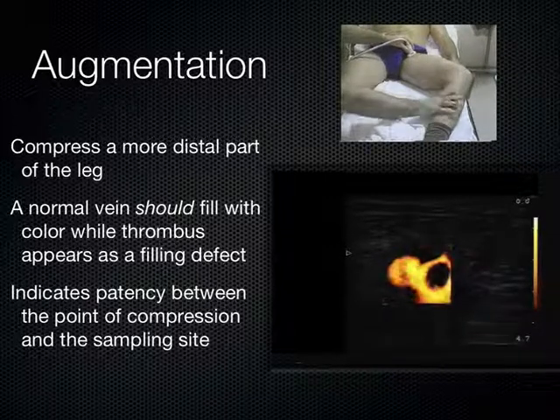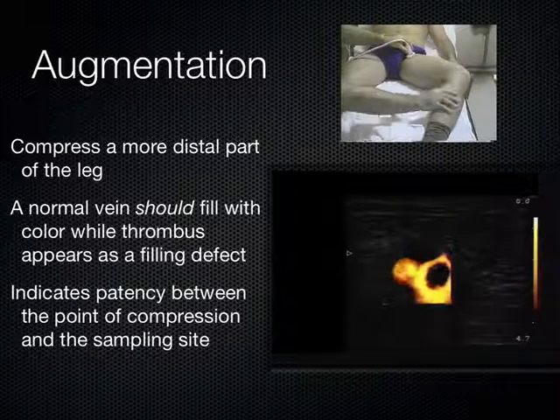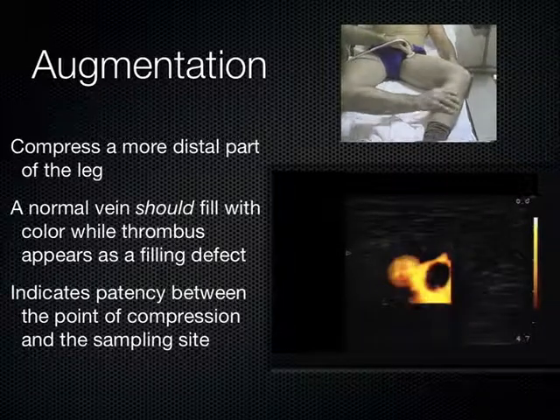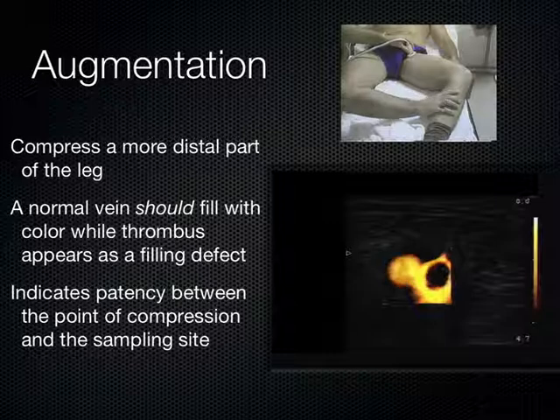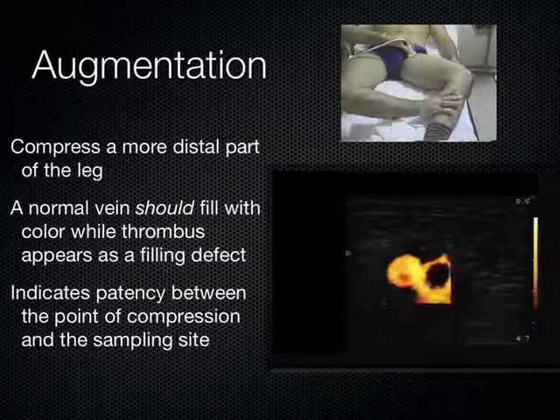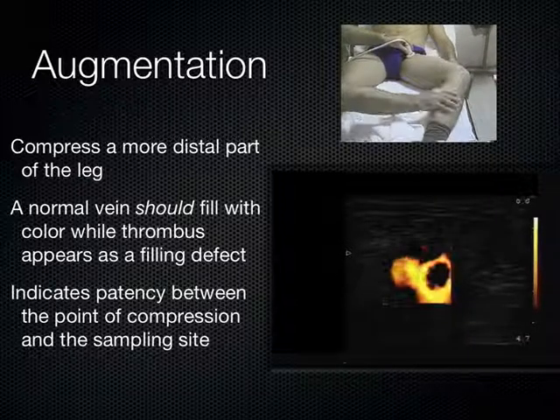So augmentation, while fun to do and occasionally diagnostically helpful, is often misleading and can't be relied upon one way or the other to rule in or out a clot. I like to teach it to medical students because it gets you involved more with Doppler and color, gets you thinking about that, outlines the vasculature, and you'll see it's kind of fun to do today when you go to practice it. You'll squeeze the calf and you'll see a big blush of flow come back either in the pop or the fem. It's kind of fun to do that. So make sure you do that today.